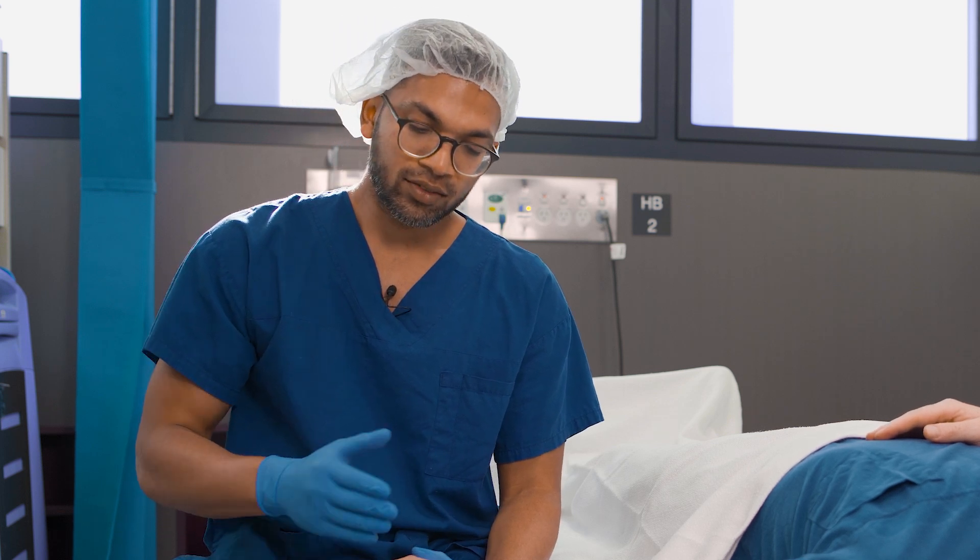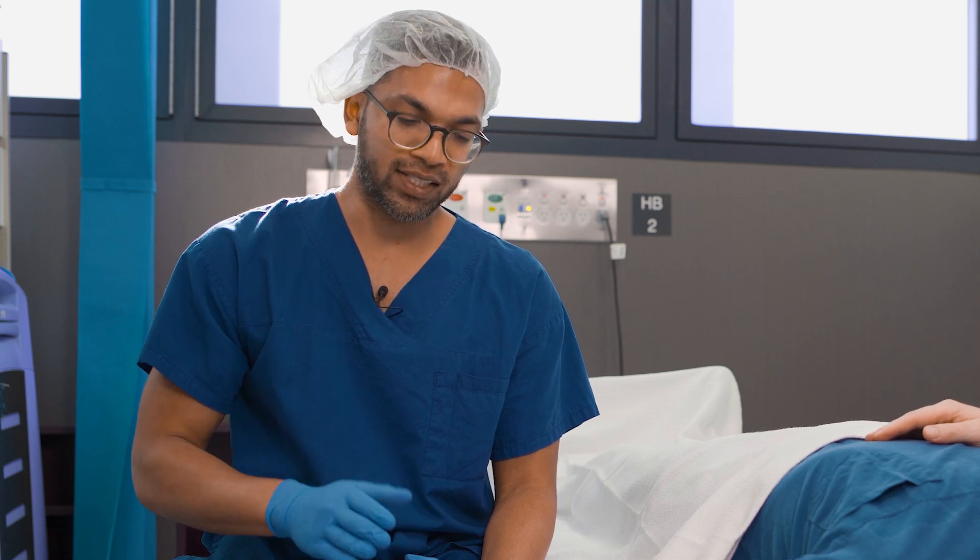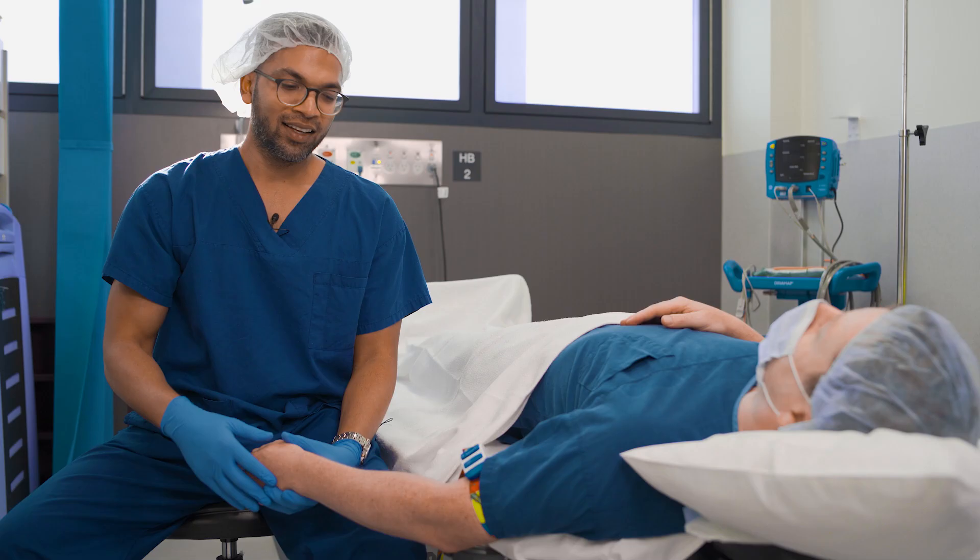The challenges with the hand are that often the veins aren't big enough for the really large resuscitation cannulas. Also, if the patient is in hospital for a few days, they won't be able to use their hand to the full extent because the cannula will probably impede that.